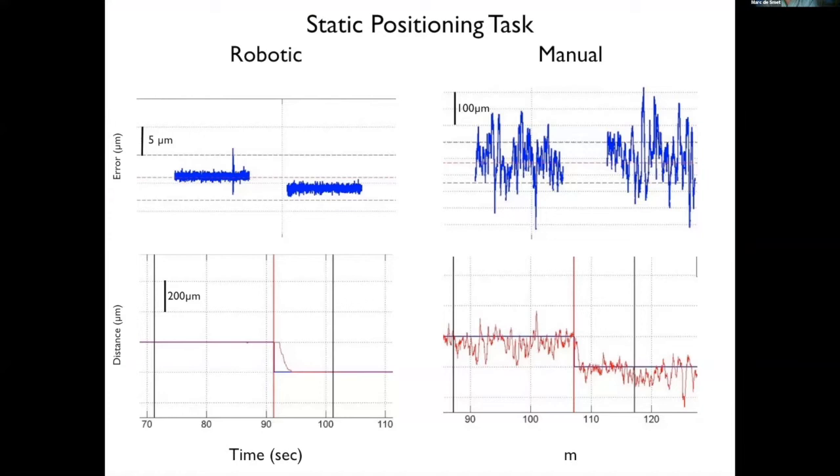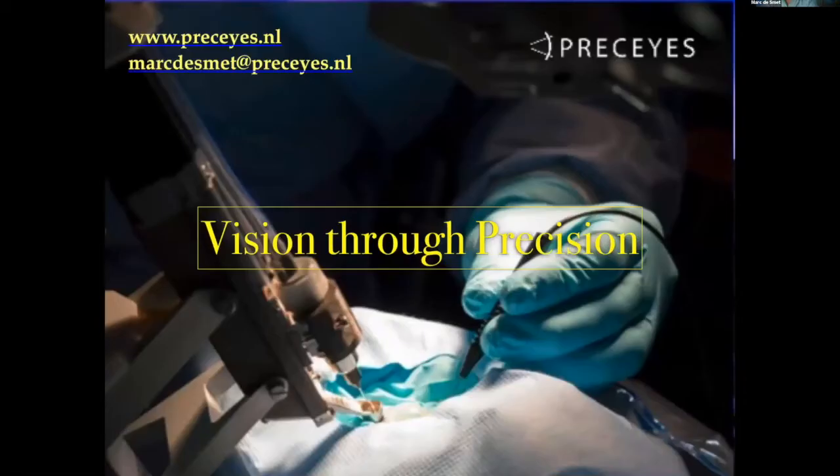In cataract surgery, for example, because we have such stability, we could go through a tiny incision, get through a tiny incision in the lens, and probably do a very, very precise lensectomy. And with regards to vitreoretinal surgery, I've shown you subretinal surgery. We can do epiretinal membrane peels. We can exchange fluid, even though we're not able to see the optic nerve. And I can go on and on, but I think I'll stop here.